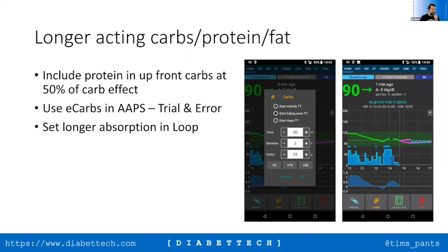The 15-minute trend is basically looking at whether you're dropping or rising. So it's suggesting that if you're dropping over the last 15 minutes, then it will take your ISF number and reduce the amount of insulin it's giving you by the drop that it's seen. Whether that's useful is up to you to decide, but I again don't use the bolus calculator. But those are just things that it's dealing with, and COB is an important one to be aware of, because you would normally expect the system to have already bolused for those carbs, and by ticking that box you may be over bolusing. It depends on how you're using it.